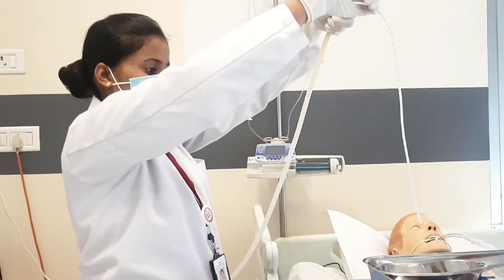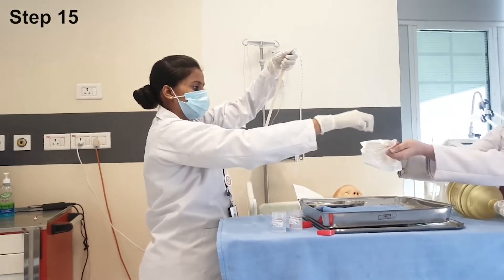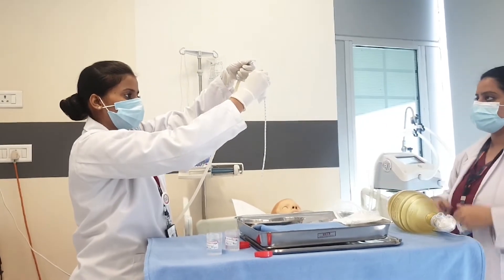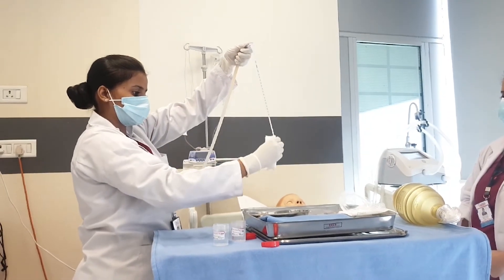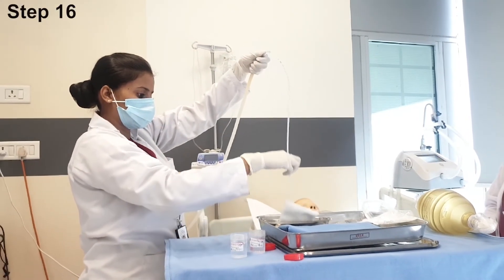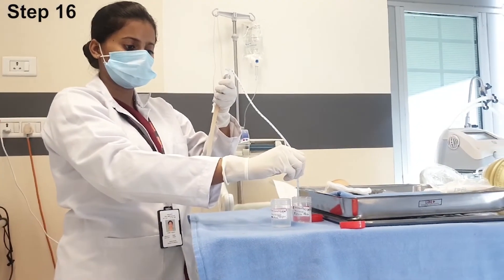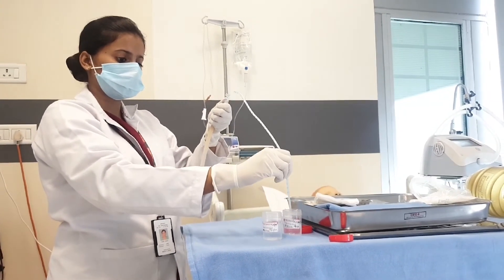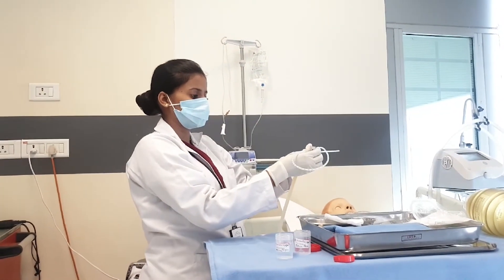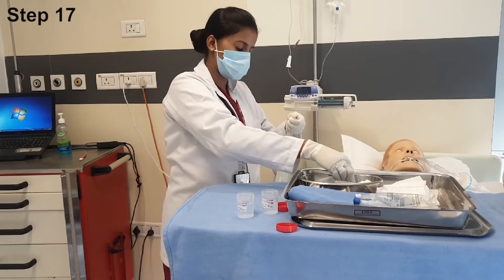Reconnect the patient with the ventilator immediately. The assistant will provide the sterile gauze piece to the assigned nurse for cleaning the suction catheter. Post-flush the suction catheter with normal saline. If secretions are still present, follow the same steps of the procedure. Detach the suction catheter and discard it in the kidney tray.